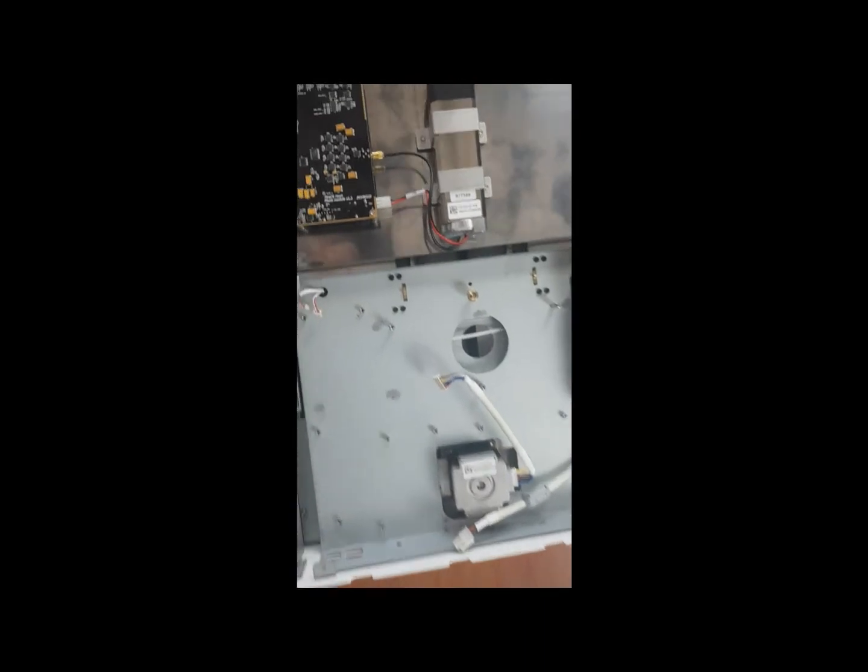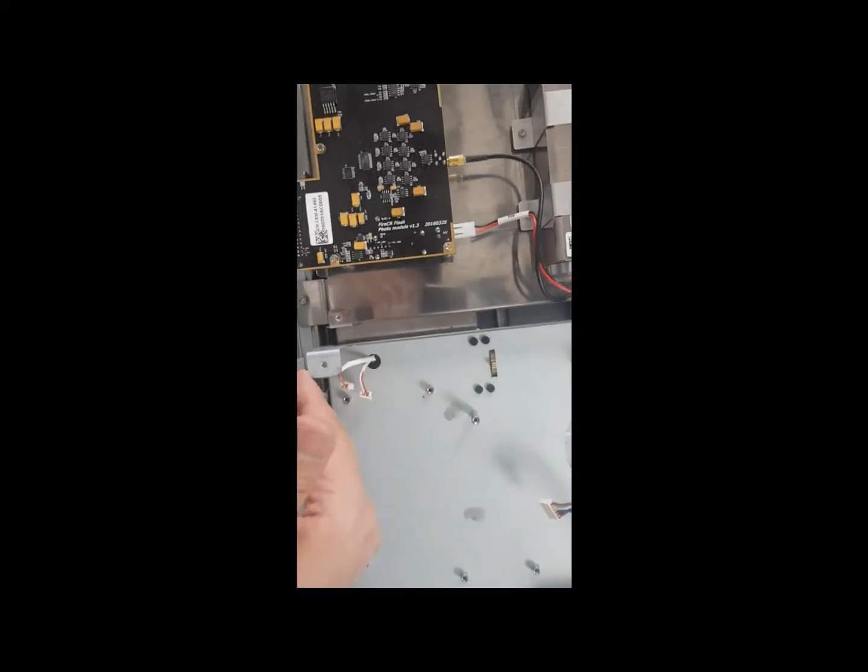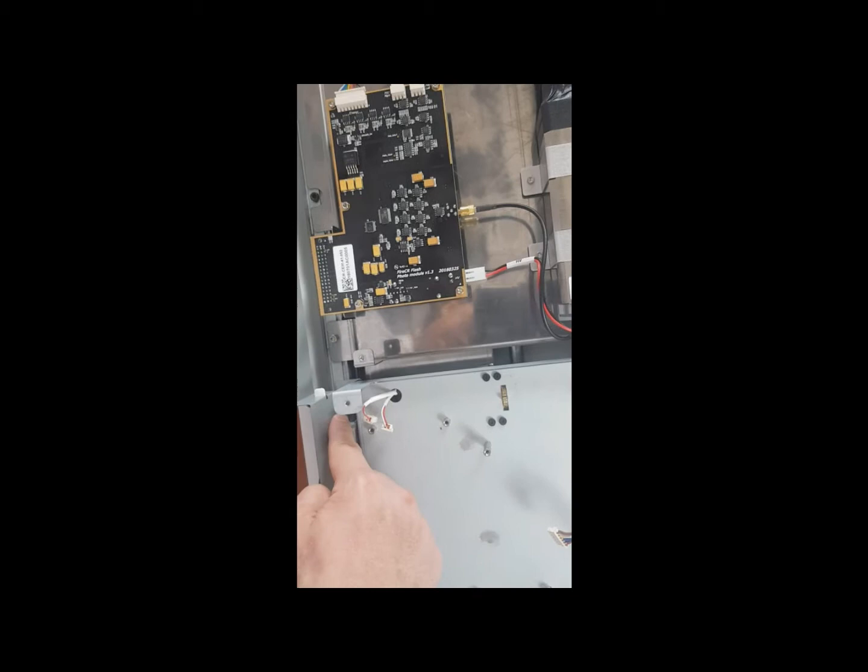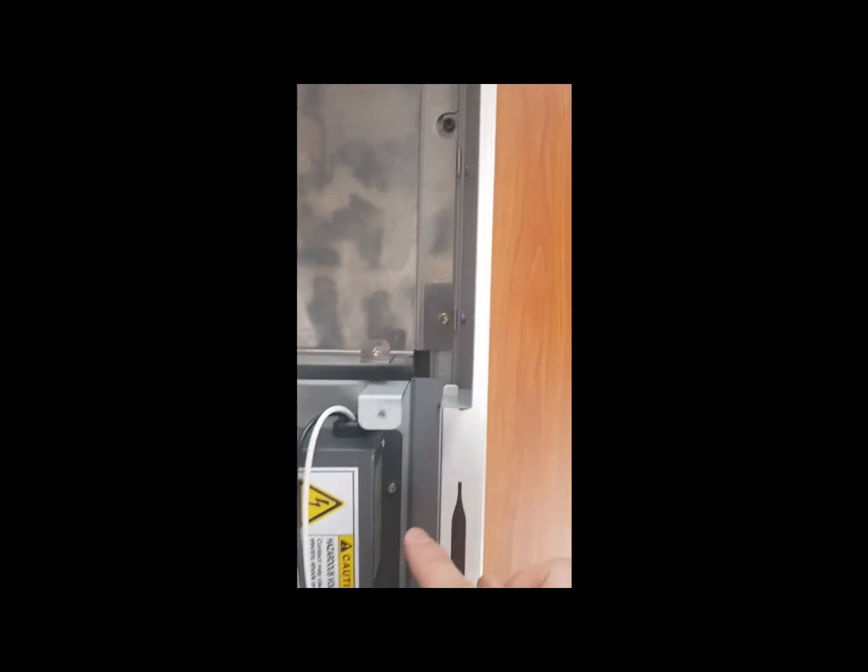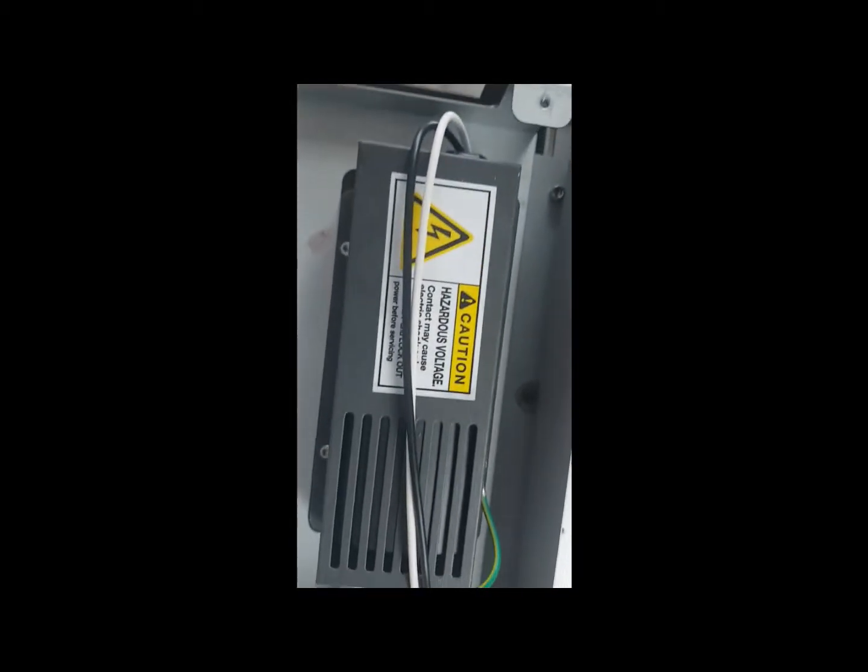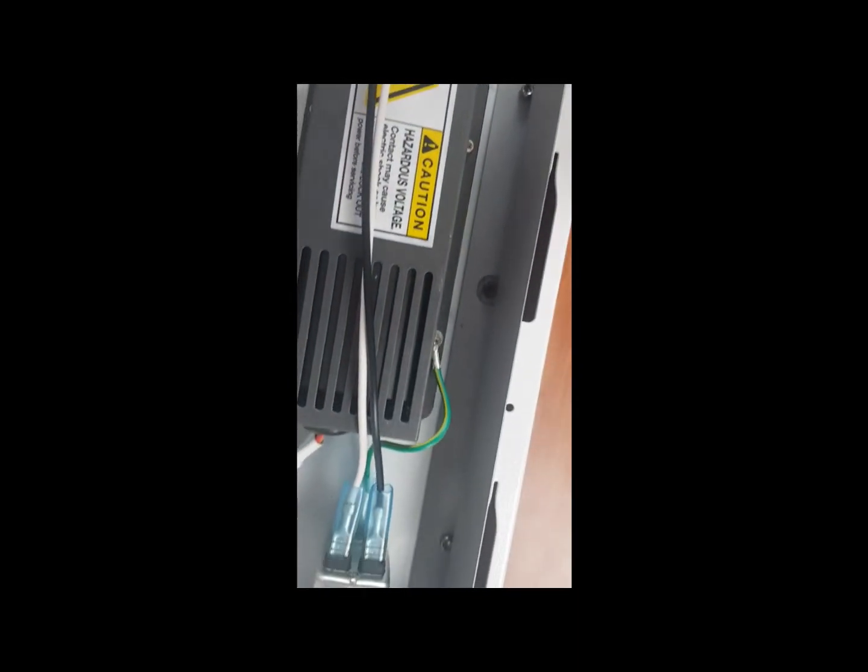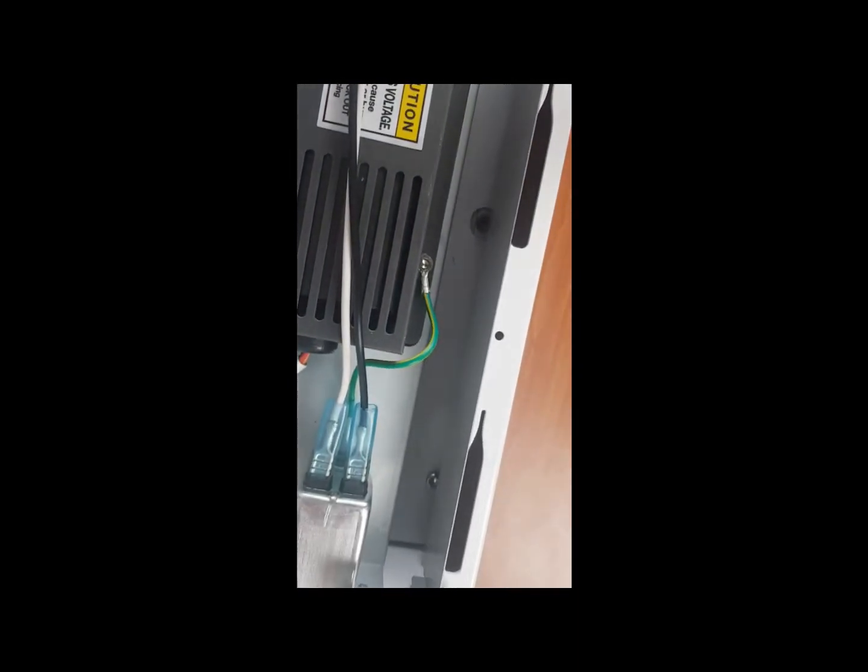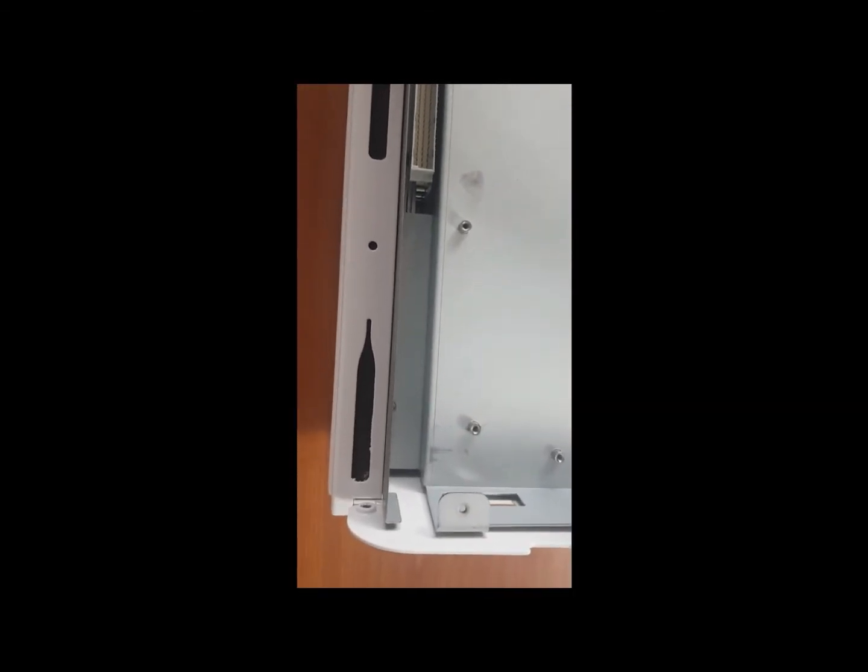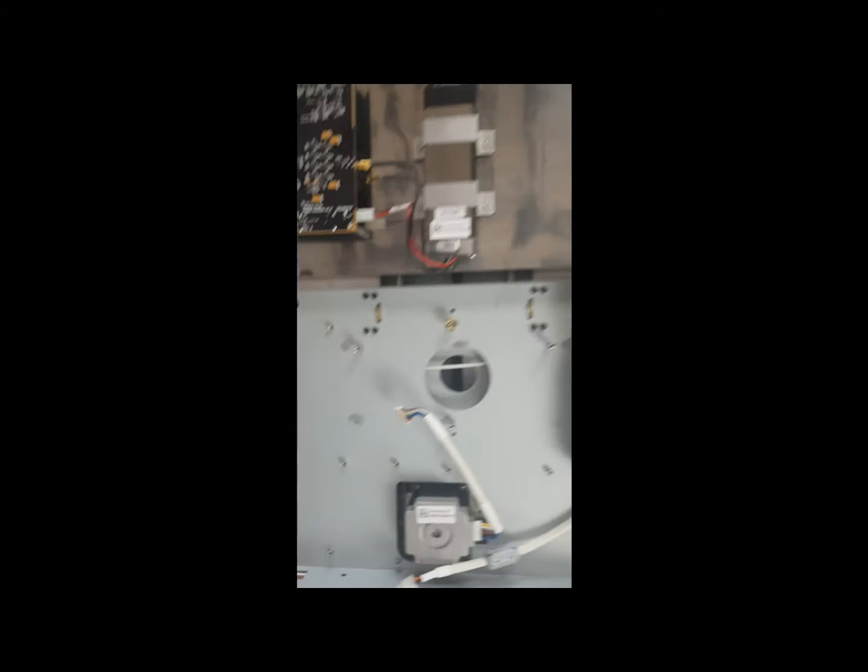To do that, you have to remove the four screws. This one here, right here, one right here, here, and here, using a 3.0 hex key.